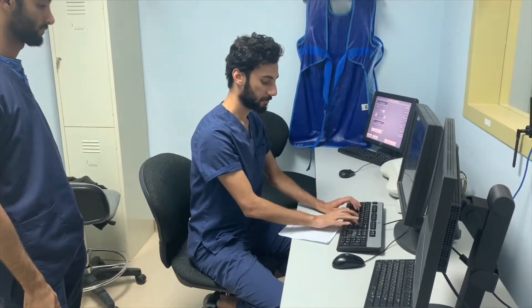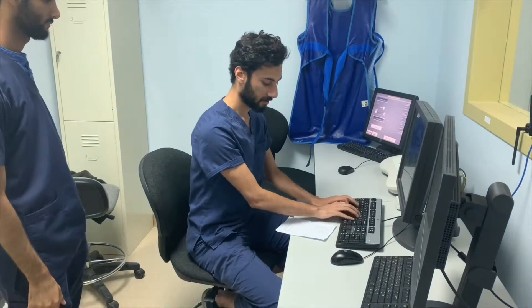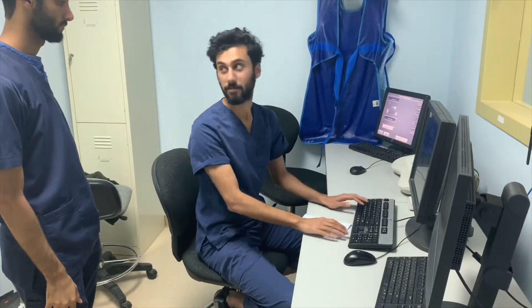He just received a diagnosis of a suspected case of osteoporosis from the subsidiary nurse. Afterwards, he asked the nurse to bring in the patient.